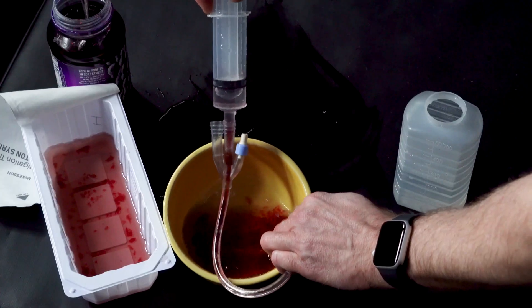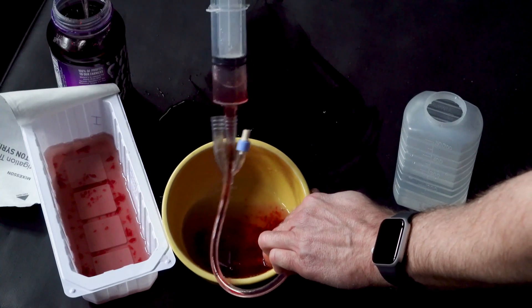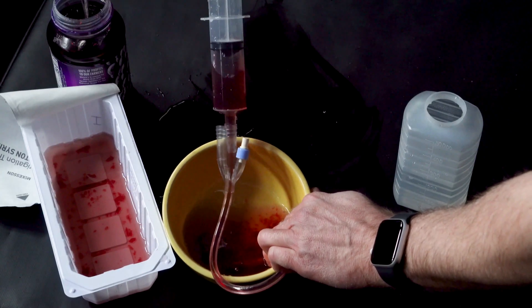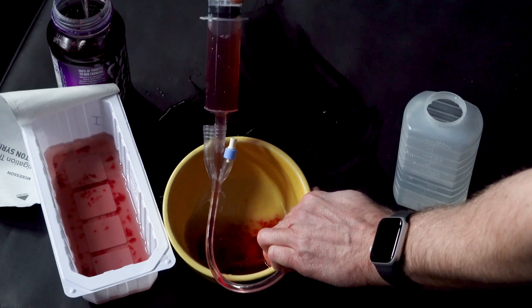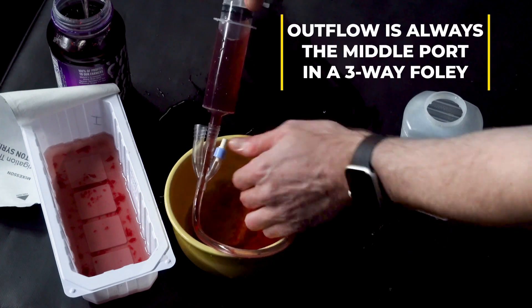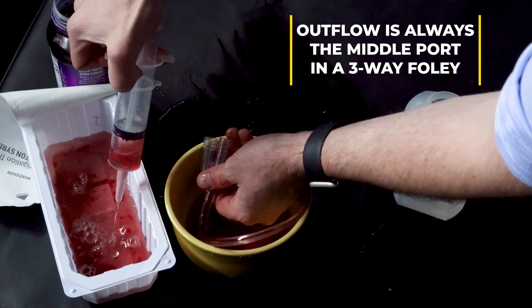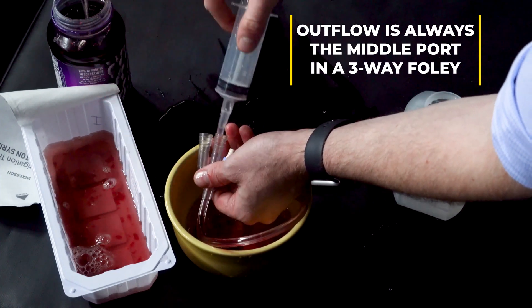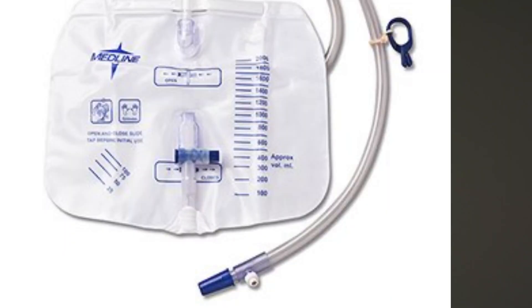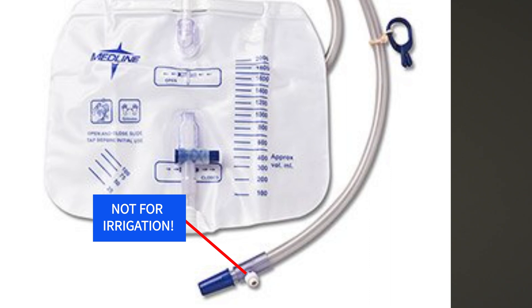In this case where the patient has large blood clots and is bleeding, irrigate all of the bladder first by use of hand irrigation. Use a catheter tip syringe. Place the syringe in the outflow port of the catheter as it is the largest channel and the one that allows you to remove blood clots. Do not use the lure lock portion of the catheter bag. This is designed for drawing a sample of urine for cultures and is completely worthless for irrigation.